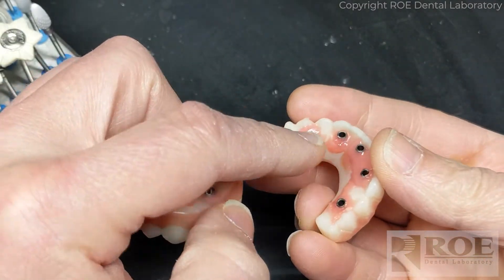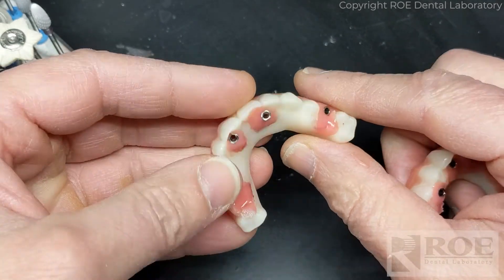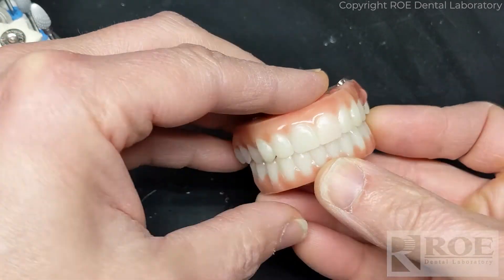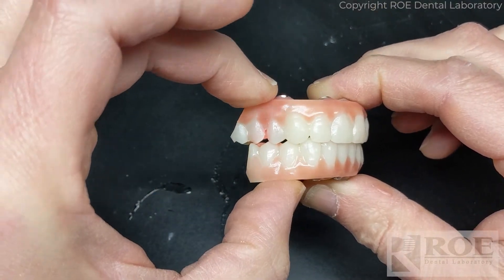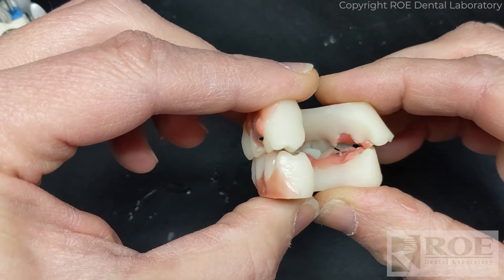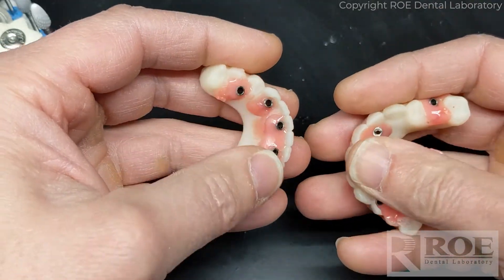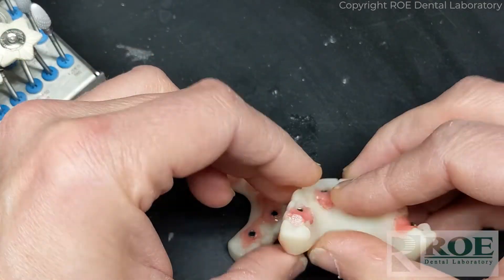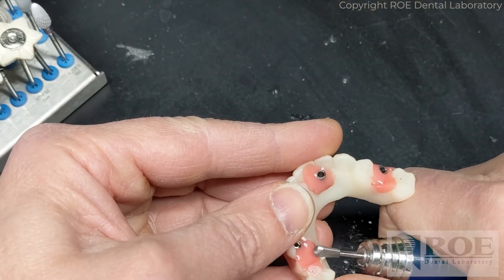Now I have added material on the two sides of the lower and filled in voids on the upper. That looks pretty good. I want to just feel it because from the photos the doctor sent, the midline was off just a tick. This is how the case goes together - really there's almost no interference, just a little bit back here. The linguals are pretty good. I'm just going to make sure it's smooth - feel it with the fingers - and then do the occlusal equilibration in the mouth.